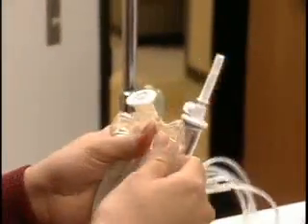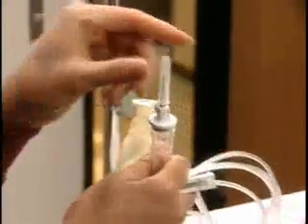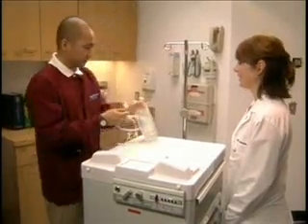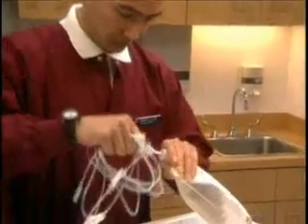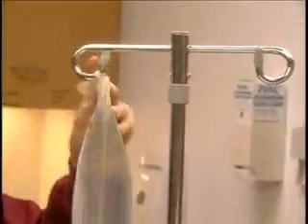And I remove the protective covering from the infusion spike, again, making sure not to touch it or contaminate it. Right. Now just hold the IV solution container steady, and I insert the spike. Oh, now use a firm push twisting motion into the entry port, right? You've got it. Okay. Now just hang the IV solution bag on the IV pole and squeeze the drip chamber until it's half filled with solution.